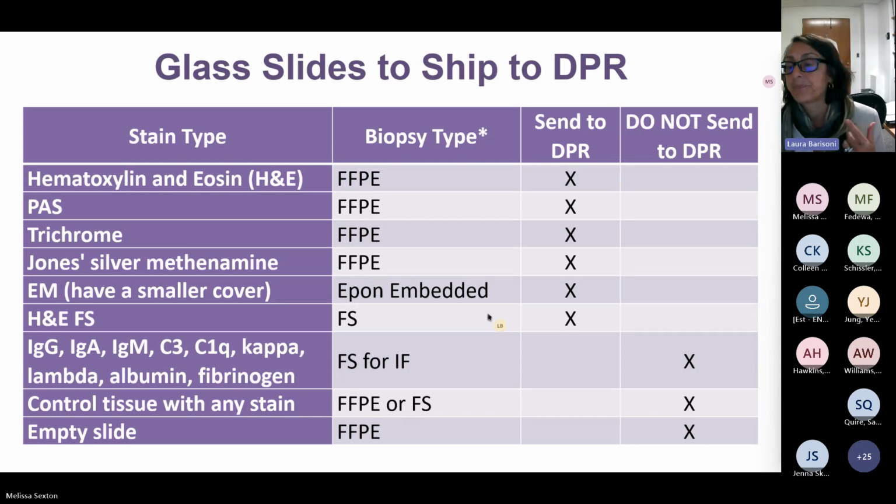Think about that. We spend money for each of the slides that we scan, so we don't want the ones that we cannot scan. Let's look at some examples. Also, if the slides are broken, don't send them to us because we cannot scan them. Next.